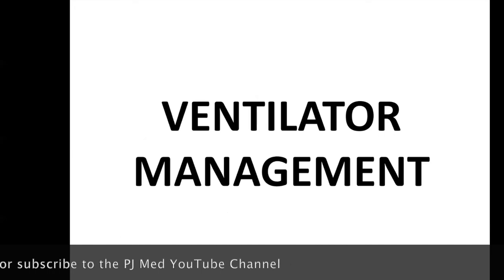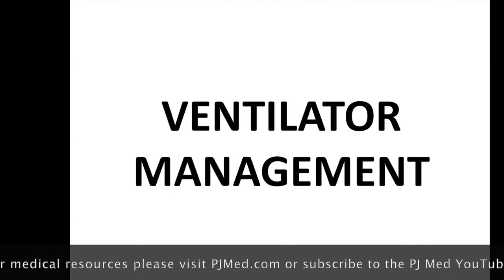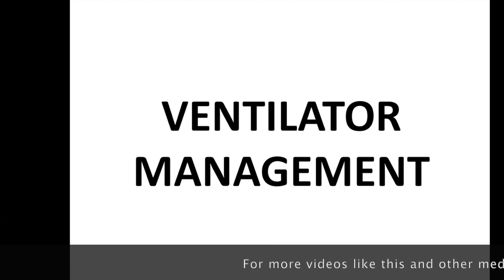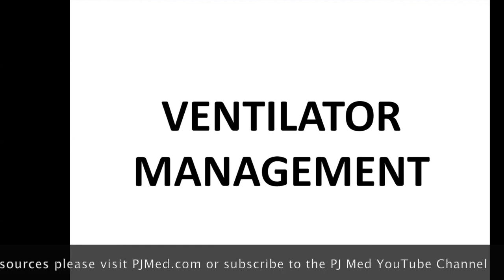Please. Great. So assist control, continuous mechanical ventilation, most aggressive, what you plug in is what the patient gets. SIMV, very similar to assist control, only now we add some breaths in between. We support the patient if they want to breathe in between. Pressure control, all pressure. We're dialing in the pressure to the ventilator. Hopefully it gets us to the tidal volume we want. It's for patients where we're worried about a really stiff lung.